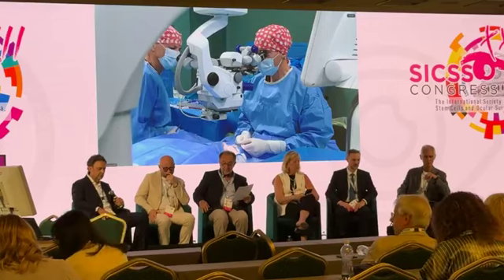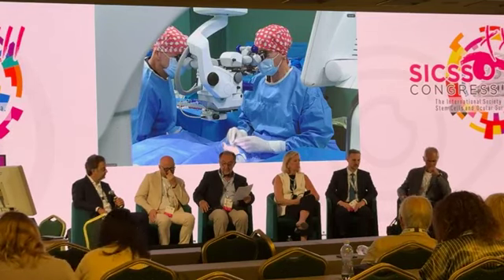So I think you already said something of the patient. As you can see, there is a little scar down here, and the planning will be to perform a DALC. Usually in this case we start with the big bubble technique, and in case of failure we move to the peeling off technique. The cornea is quite large, so I can show you this is 9, and I think it fits quite well.